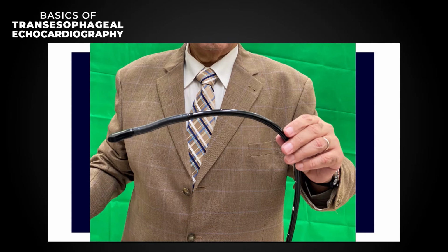If you are going to cardiovert a patient, your focus is the left atrial appendage. I will not go to the upper esophageal or the transgastric views. I will stay in the mid-esophageal view, check the left atrial appendage, and keep it in view at 0, 30, 90, 120, and be sure that the left atrial appendage is patent. So it depends on the indication and the structure you want to look for.